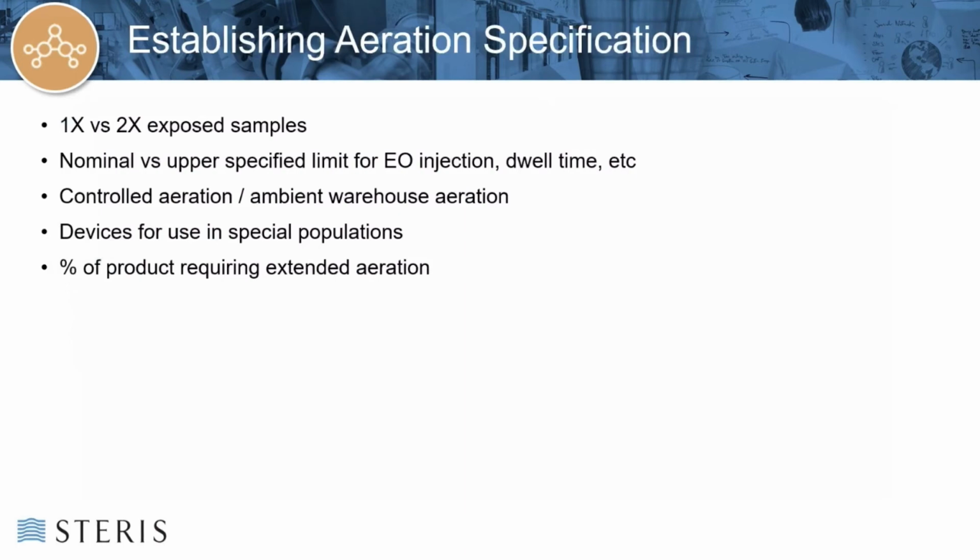Establishing aeration times off the worst case condition may not always be the appropriate course. Establishing aeration time from product process through a single cycle may be more appropriate for routine release than using the aeration from product process through 2 cycles to account for reprocessing. The necessary aeration for 2X product should still be obtained and proceduralized for when it is necessary, but not necessarily used for every routine run.